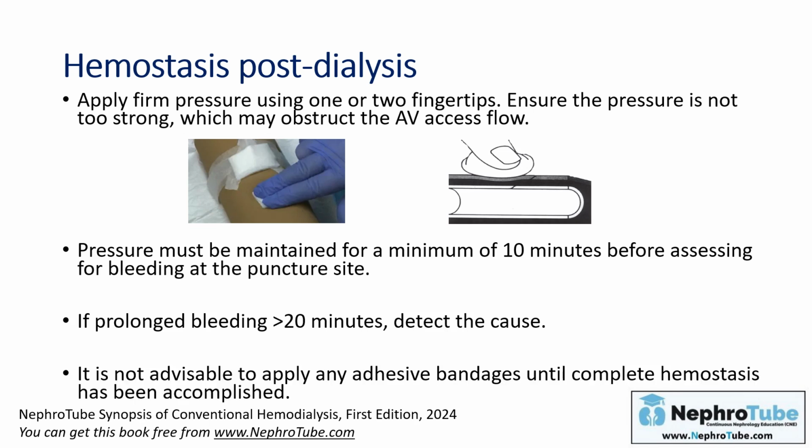Finally, it is not advisable to apply the adhesive bandages until complete hemostasis has been achieved. It is important because we saw before some patients who had their adhesive bandages, and when they went home, they found bleeding from the fistula site. So be sure of complete hemostasis before sending your patient home.